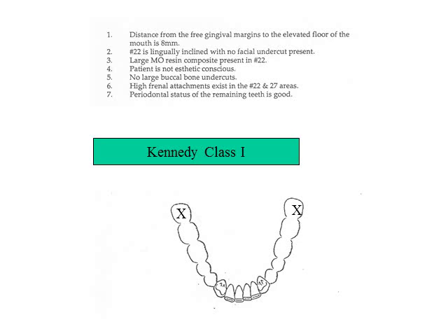Based on these factors, one may choose to place a surveyed crown to address these issues prior to fabricating the removable prosthesis. This surveyed crown should be designed with an appropriate rest seat, guide plane and suitable undercut. High frenal attachments rule out the use of bar clasps, and since aesthetics is not a factor, a wrought wire clasp to .02 undercut is planned.